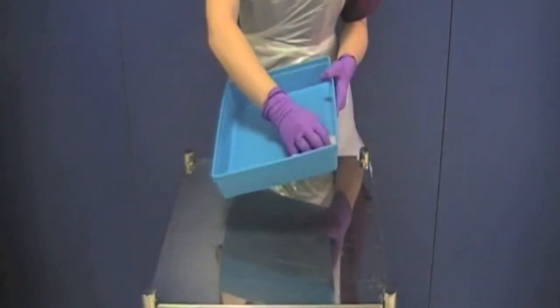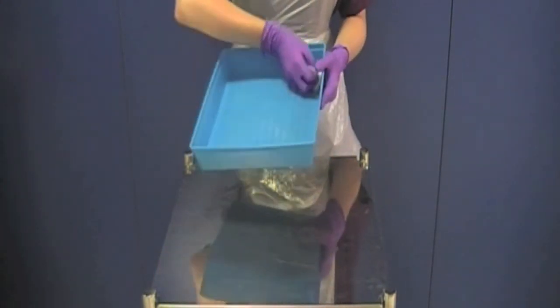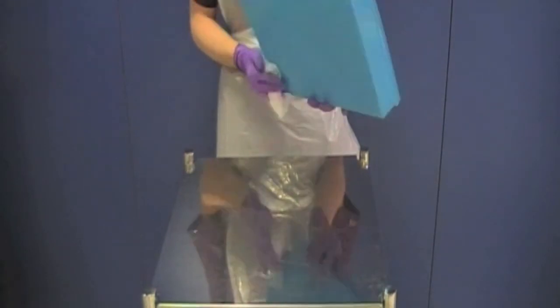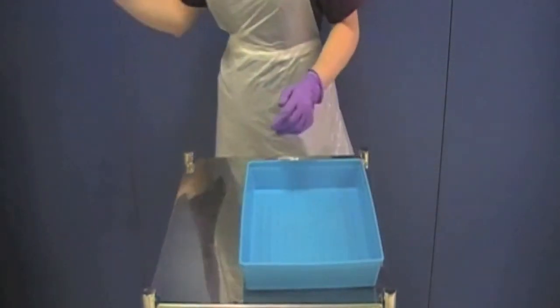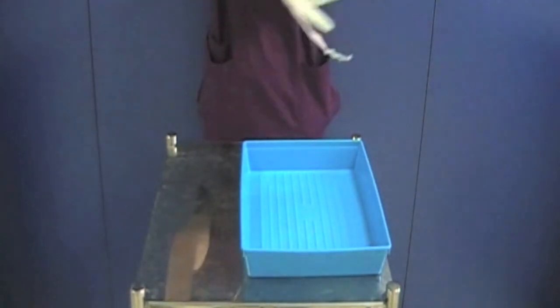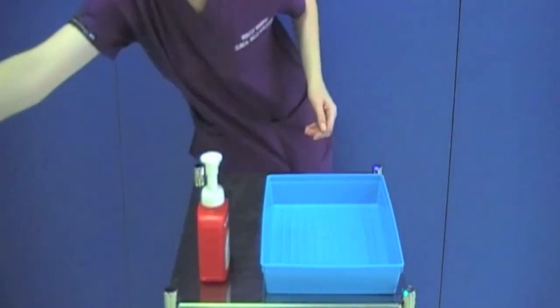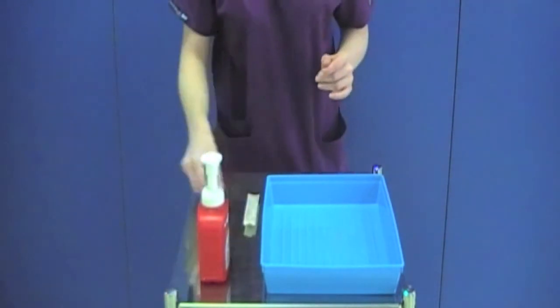During this time you can clean your tray. Clean the inside first and then the outside using a different wipe for each. Remove your gloves and apron. Decontaminate your hands and wait for the tray to dry for 3 minutes. During this time you can gather the equipment onto the trolley, making sure that there is a sharps bin to hand. Do not put the unopened equipment in the tray at this point.